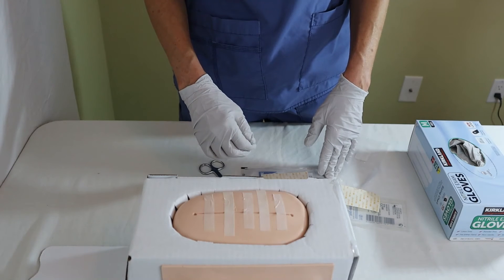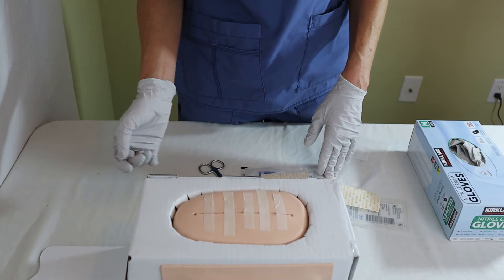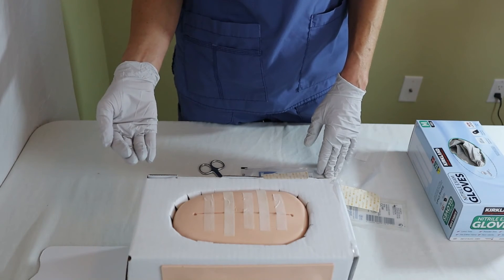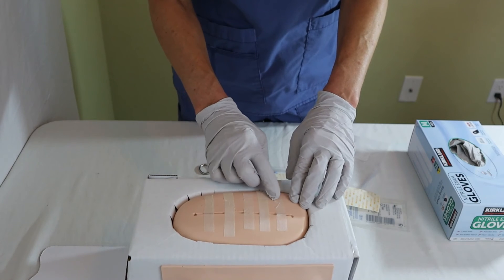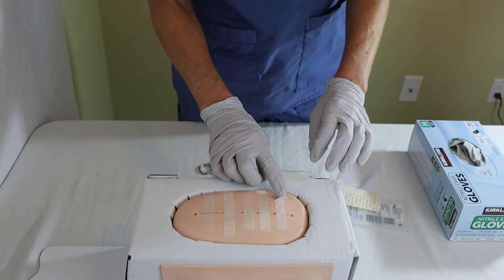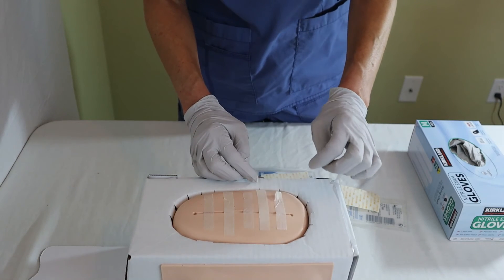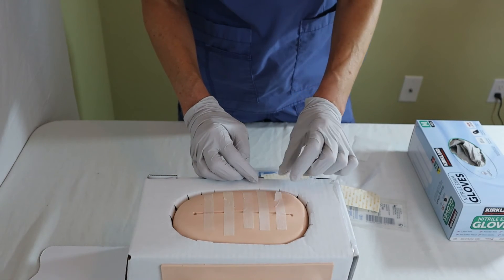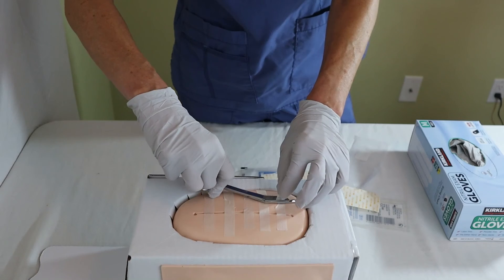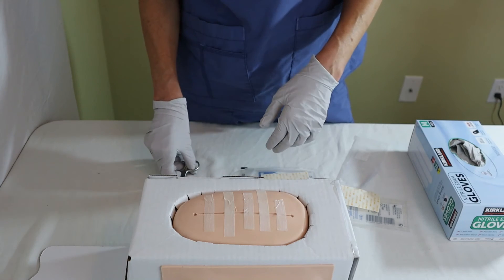The patient will usually ask when these come off, and the answer is they don't come off — they will fall off automatically. At this point of wound healing, the patient will be able to shower, and eventually the edges will start to peel off. The best thing to tell the patient is: if the edges start to peel, don't pull off the SteriStrip because you might disrupt any granulation tissue or open the wound again. Just trim the edges, and eventually the strips will fall off on their own.